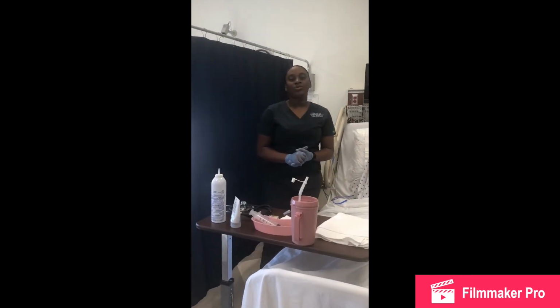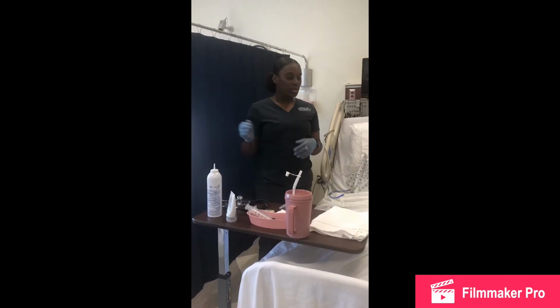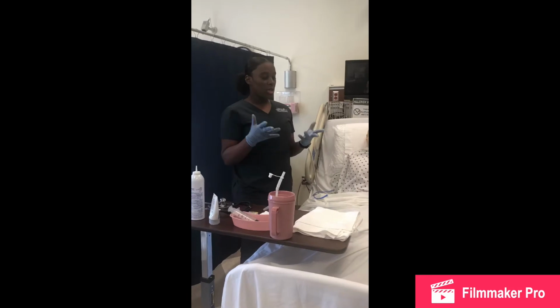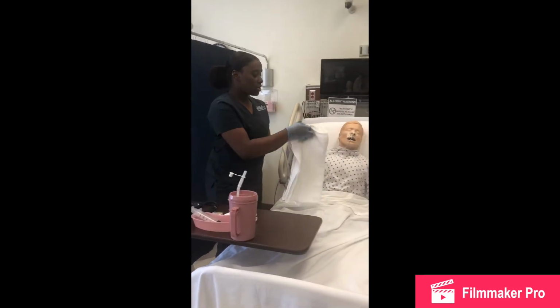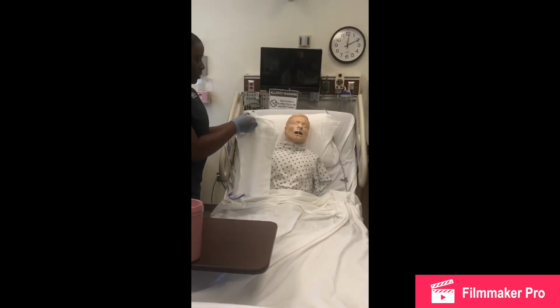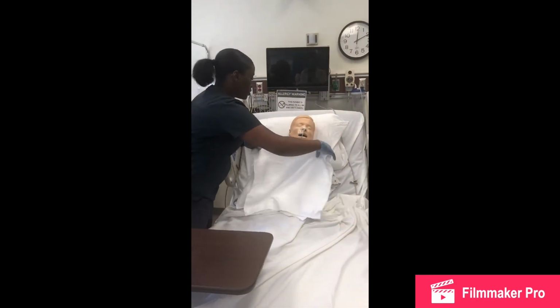Now I'm going to remove my patient's NG tube. I'm going to make sure that I create privacy, put my patient in the right position, and have on clean gloves. I would then put a towel over my patient's chest area just to catch any secretions coming out.